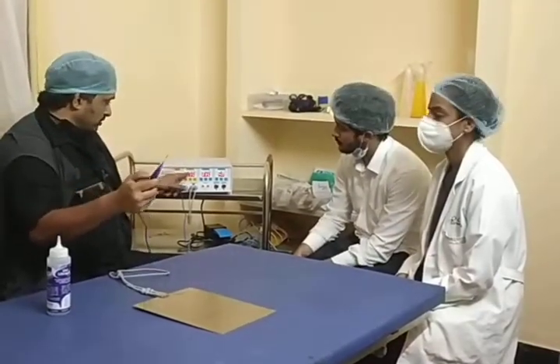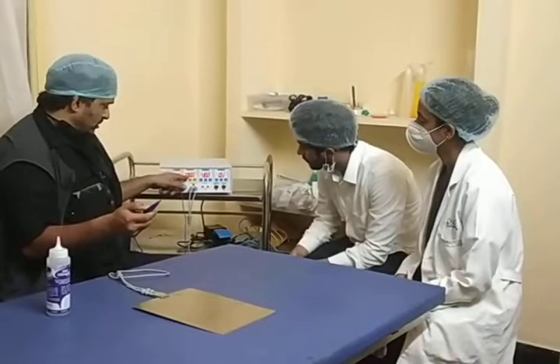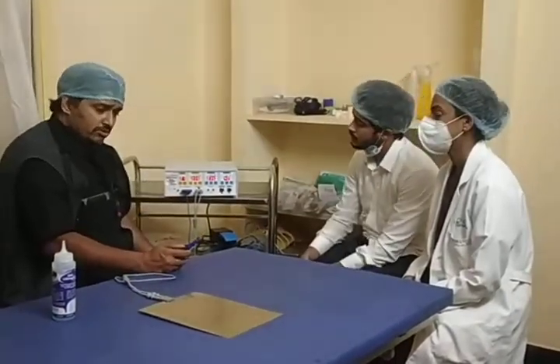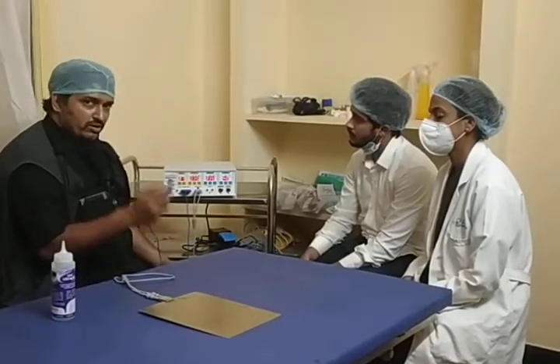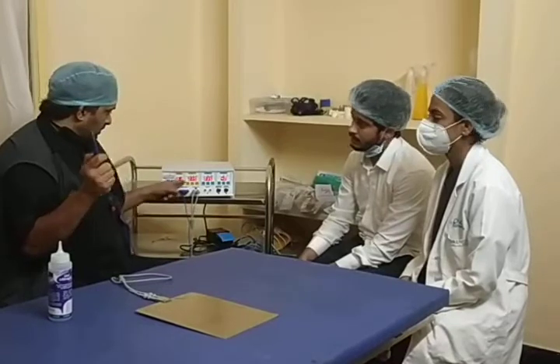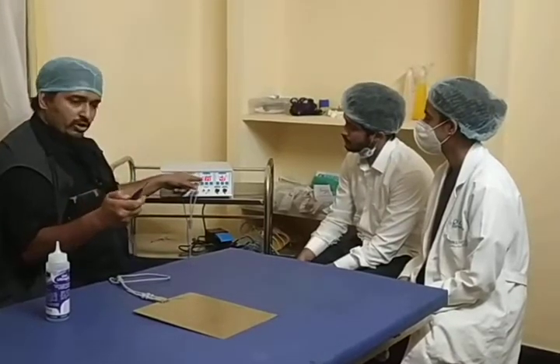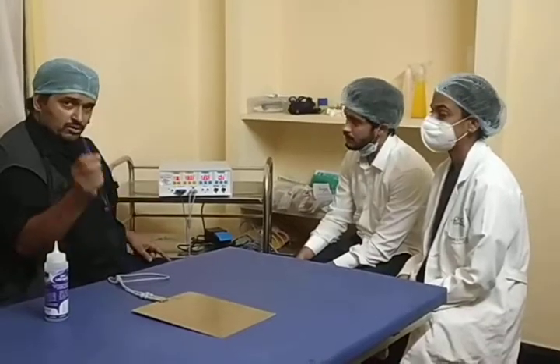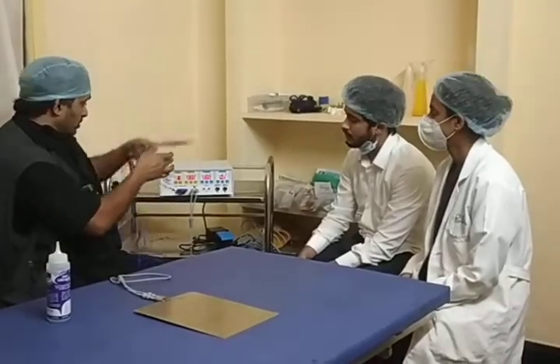And then this is one option, the cut option. When I press this option, the reading is around 35 to 45. You should not select a very high option because it causes heat trauma. Just make sure you have selected one just adequate to serve the purpose. So this is the cut option and this is the coagulate option. When I press the coag button, I have the coag option, I have the cut option. Now, this is the hand operated switch. I'm going to leave it aside for a moment.